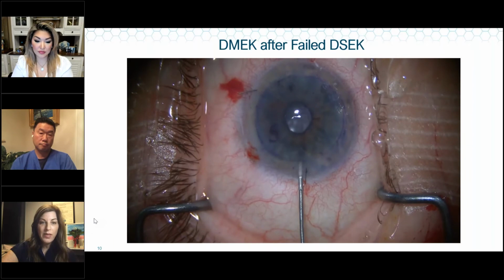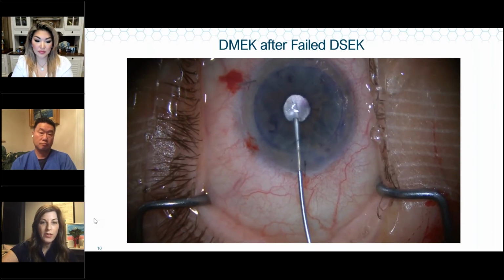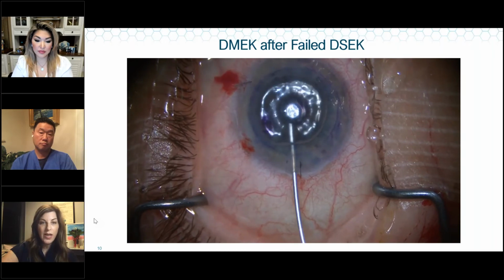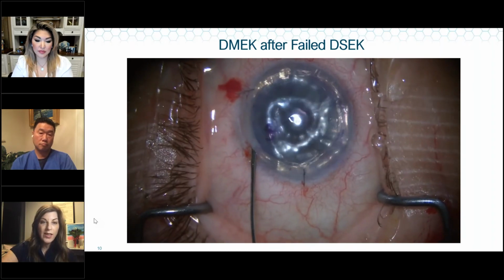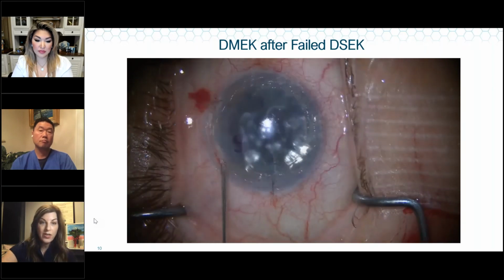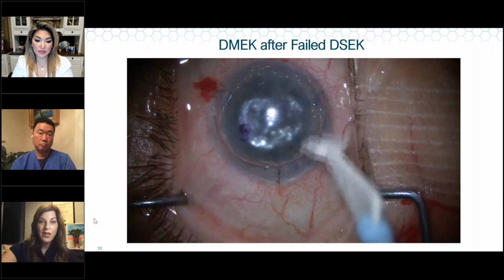So this is on a TB syringe that I'm going in with, and I'm just going to do a little air bubble here, just a little bit. I'm at the pupillary margin, but I go slowly. Then I'm going to come out and go towards the side like I'm hydrating my main incision, but with air. And then you can get that really tight fill.